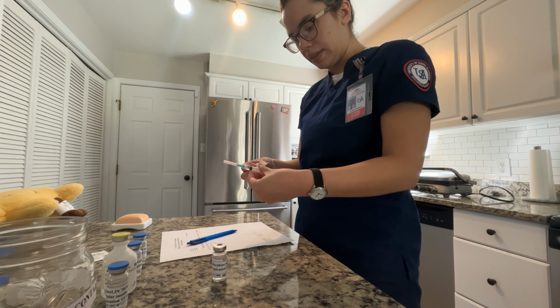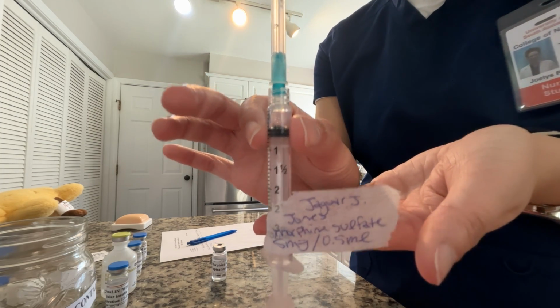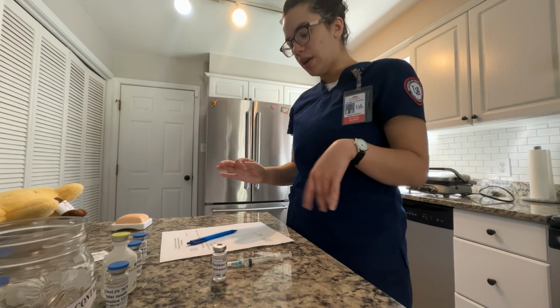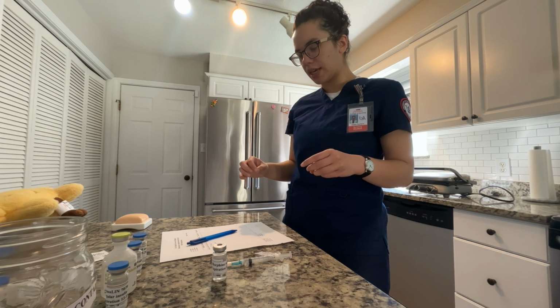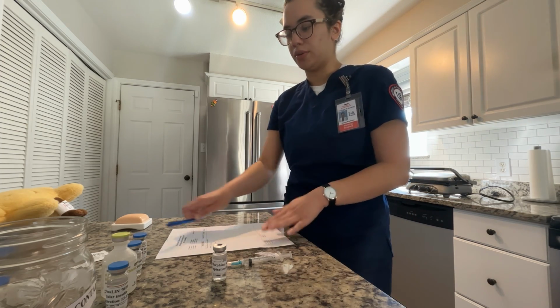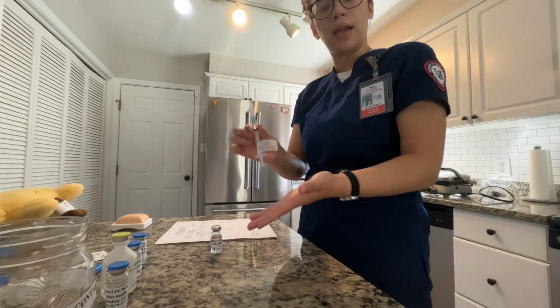So I'm going to take this and put it on my syringe. Here is my label with patient name, name of drug, and dosage that he is getting. So that concludes my second check for the 7 rights of accuracy. So now I'm going to go to my patient's room. I'm going to bring my MAR, my vial, and my syringe.